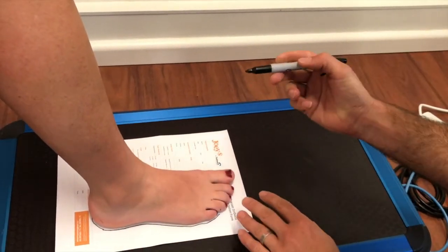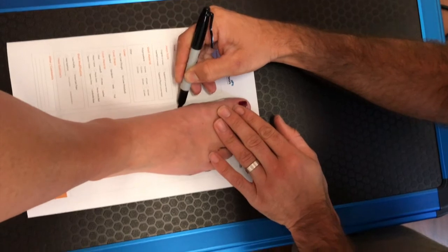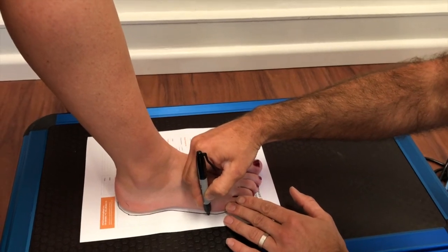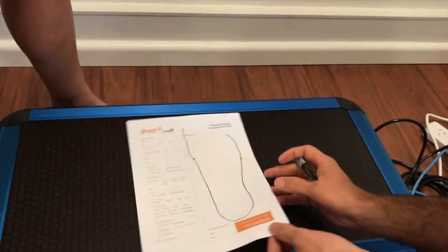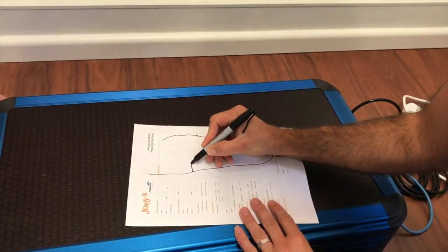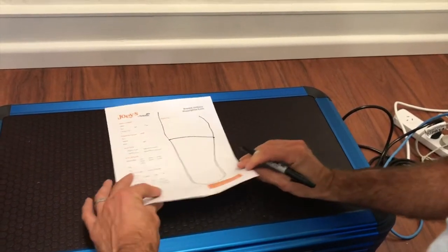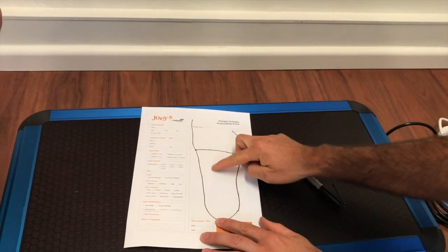The next step is to determine the length of the orthotic. You do this by locating the area just posterior to the 1st and 5th MTPJs. Usually this is approximately 5 to 10 millimeters posterior to the midline of the 1st MTPJ. You can then remove the client's foot and sketch the anterior border of the orthotic. This will be used by the lab to determine the length of the orthotic shell, and only a single foot tracing is required as the lab will manufacture a pair to the same specification.